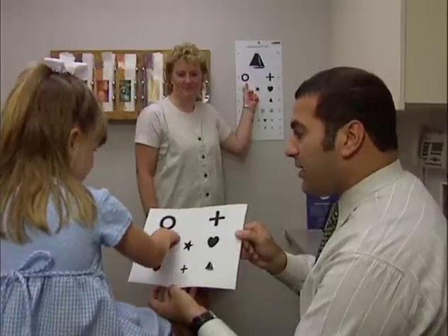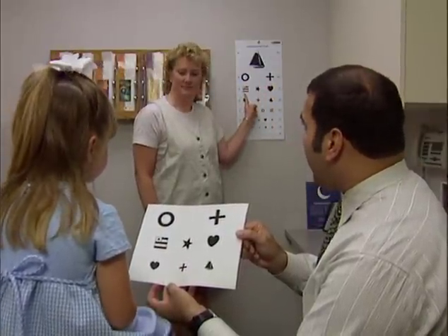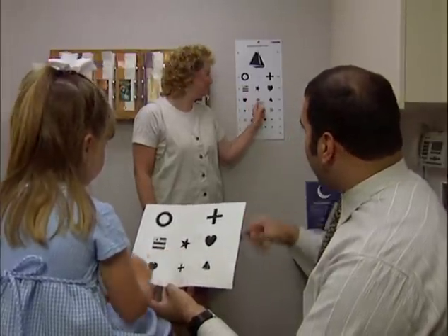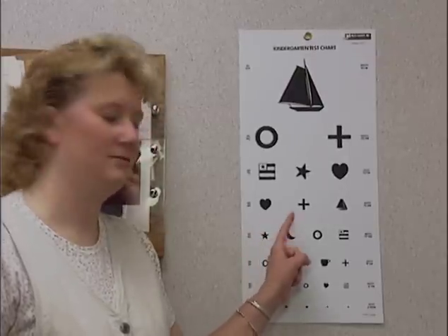In a 2.5 to 3.5-year-old child, you can measure visual acuity with a picture chart. You can make this a matching game by giving the child a copy of the pictures that they can point to. Having the parent point to the pictures on the chart can help the child focus on the task of identifying the pictures.